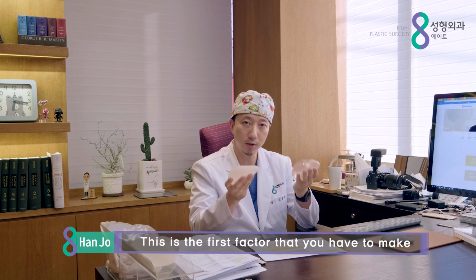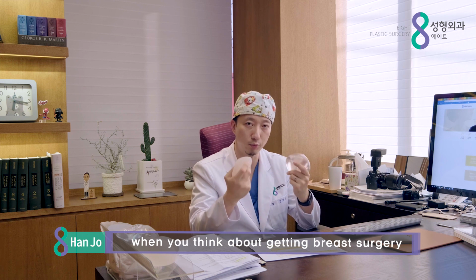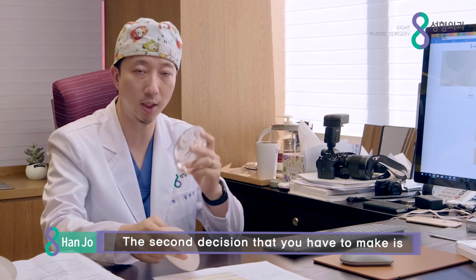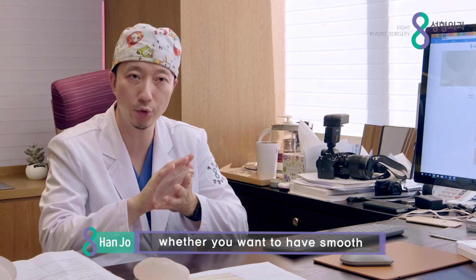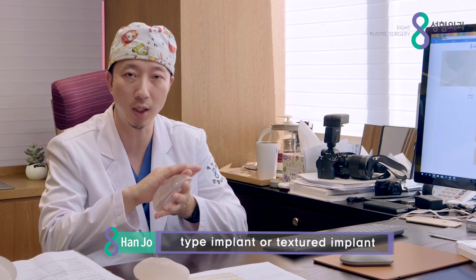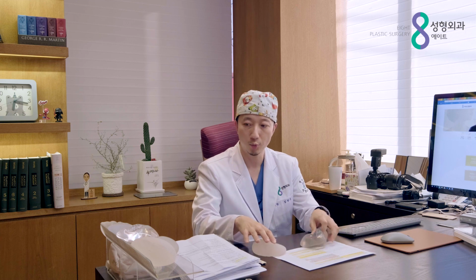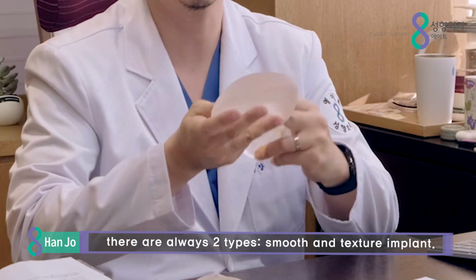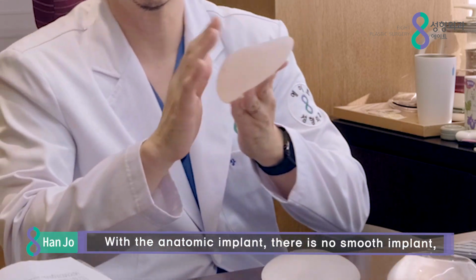So this is the first decision that you have to make when you're thinking about having breast surgery, whether you want a round or anatomic implant. The second decision that you have to make is whether we want to have a smooth type of surface or a very textured kind of surface. So with the round implants, they're always a smooth and a textured implant. With an anatomic implant, there is no smooth implant.